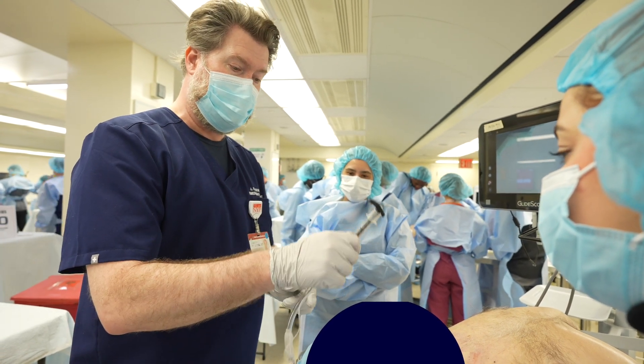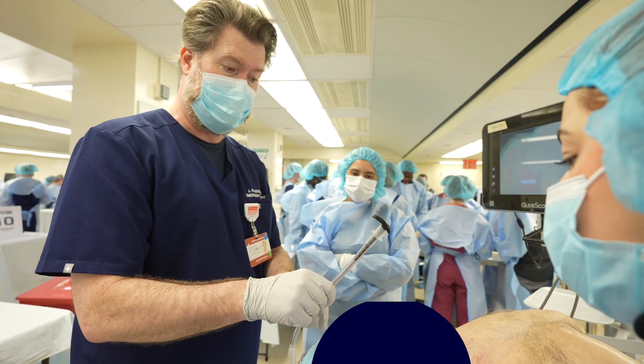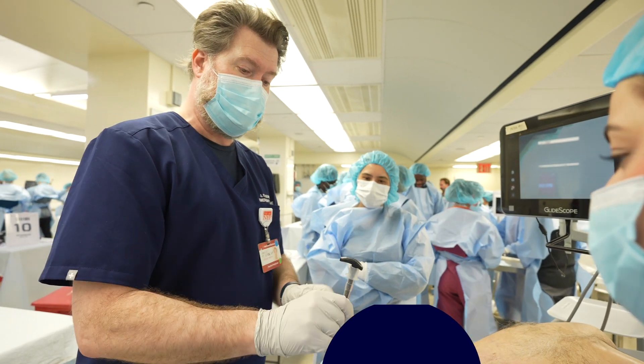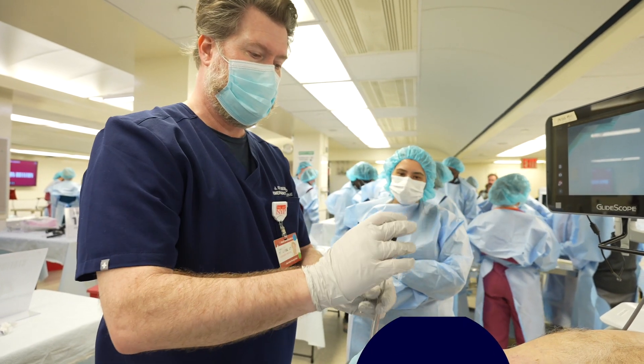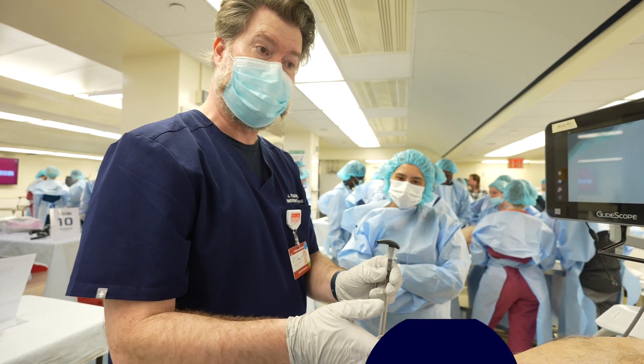Most people when they go in are holding it here or here. They're often pushing and then have to come up with two hands, or they're trying to switch like this. It gets very complicated and slows things down.